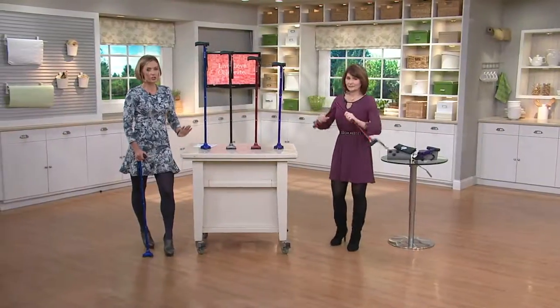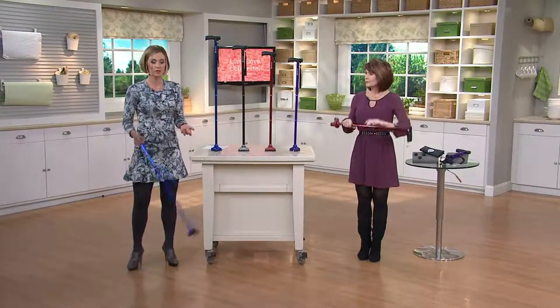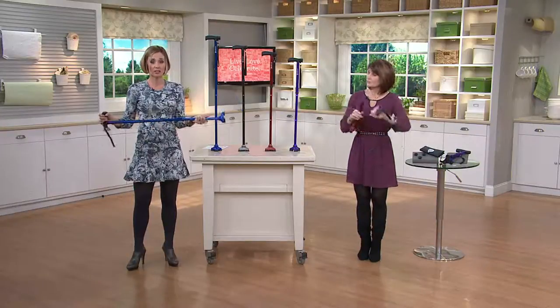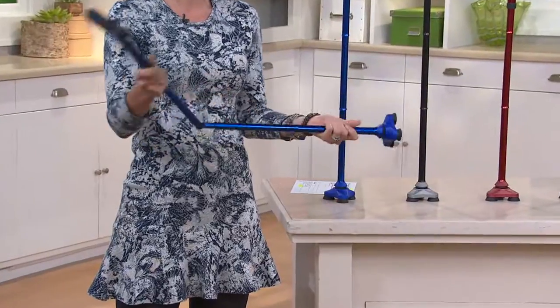Really easy. And if you were to just get the HurryCane and the extra feet at retail, it would be $49. So you save more than $10 plus you get the little bag. I do love that it's adjustable, and like you see Denise doing over there, it folds up every single time.